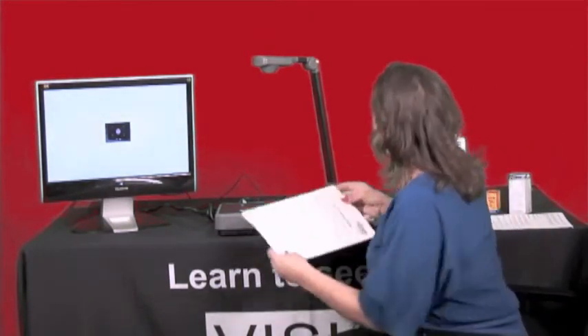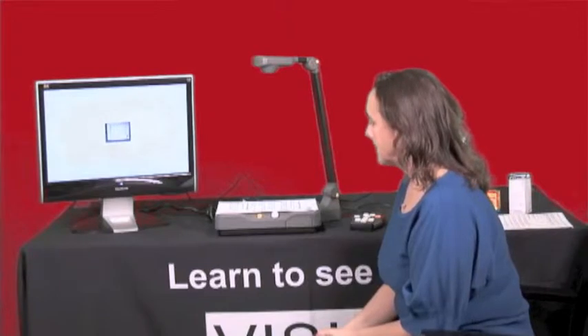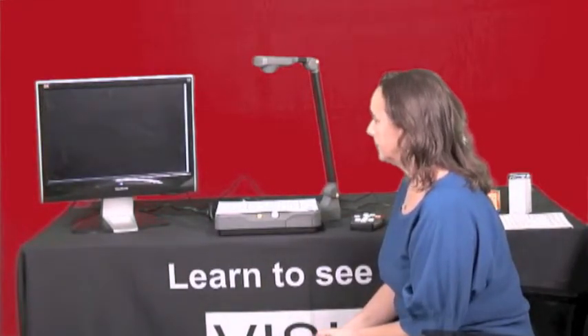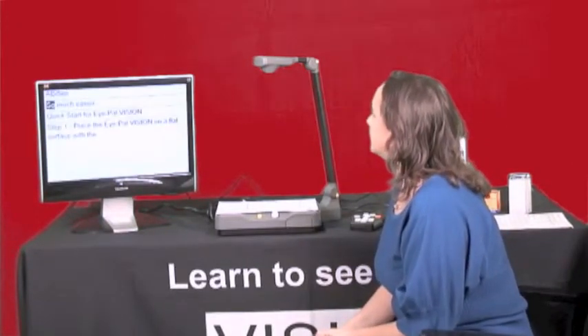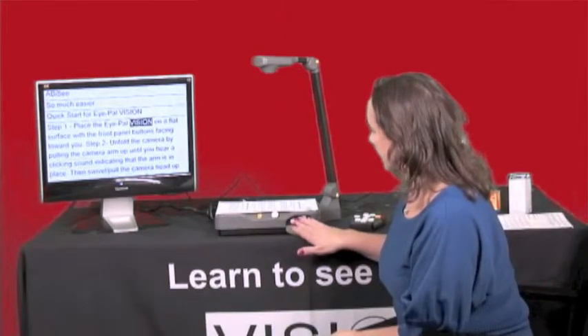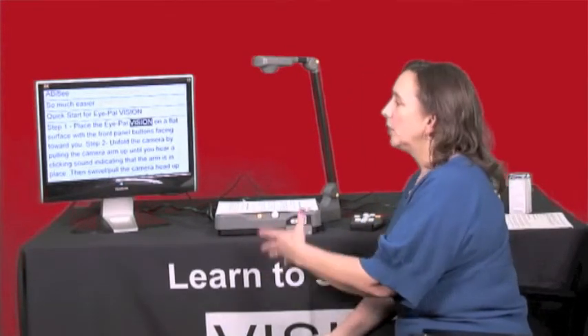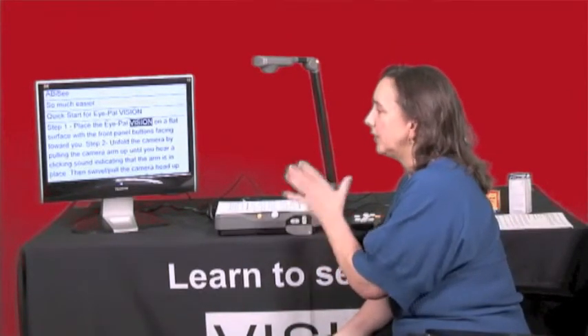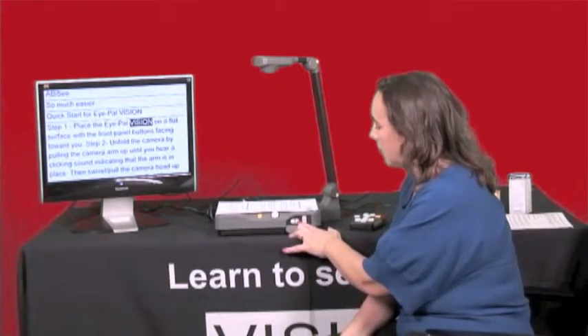So I'm going to put my print underneath the camera — anything about eight and a half by eleven. The camera took a picture of it and now it's ready to go. It began reading the quick start guide. In review: I turned it on, heard the music, heard the camera warm up, heard the words 'please place your document,' placed the print down, the camera took a picture, and then I used the pause button to stop for a minute to speak with you.